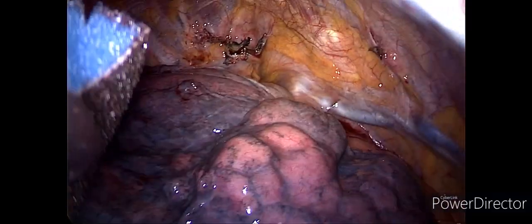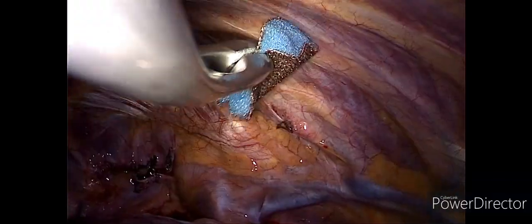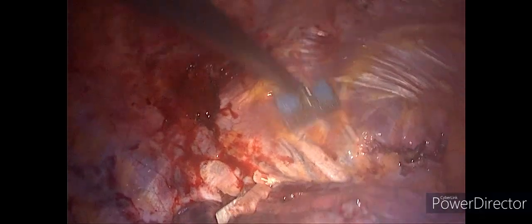Our next step is mechanical pleurodesis. Many ways have been discussed. Our approach is mechanical abrasion using a scratch pad on the anterior, lateral, and posterior surface of the parietal pleura.